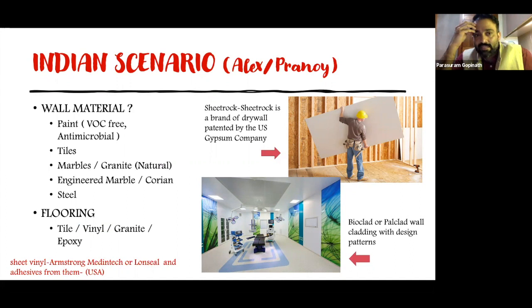I agree with Jason on these geographical differences in kind of material people can use for the clean room. The basic idea is that it should be easily cleanable. And second, the material, the wall, floor, or the ceiling should be VOC-free material.